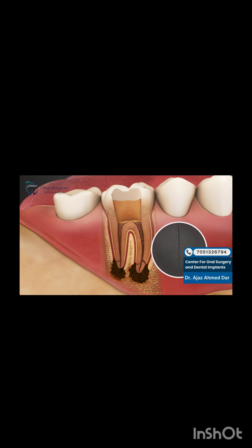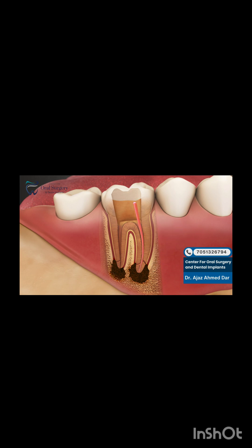Once completed, the canals are further prepared using rotary instruments that open up the canals to a precise taper in length. A flexible plastic material called gutta percha is then used to fill each canal, sealing it and protecting it from damaging bacteria.